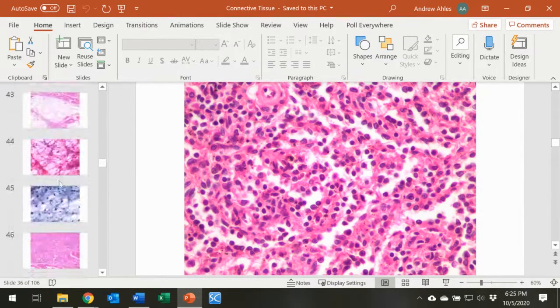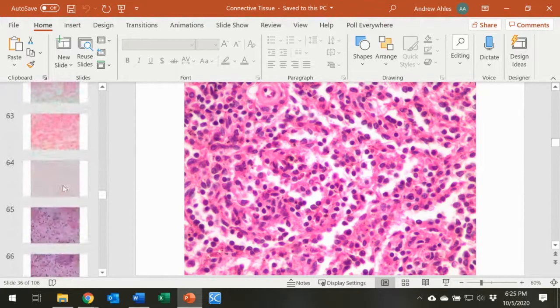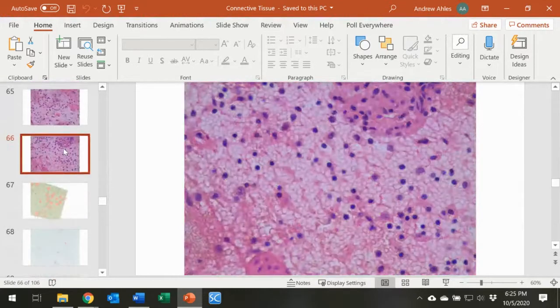My favorite one, again, let me scroll down, is right here. So this one is a much easier way to see all of those different reticular proteins that are mixed inside there. Any other types of tissue that we wanted to make sure to take a peek at?